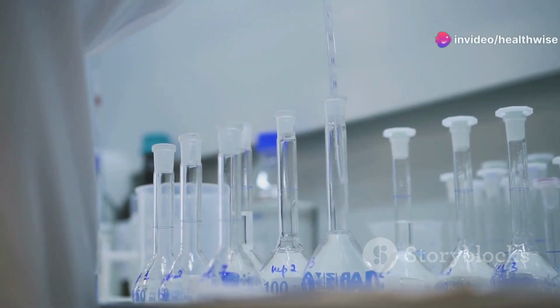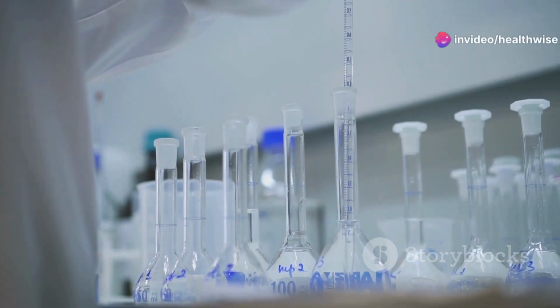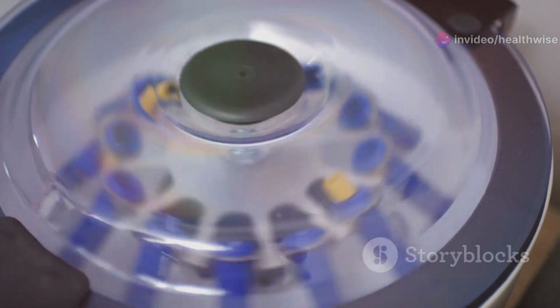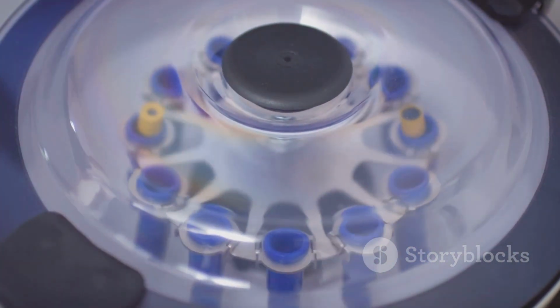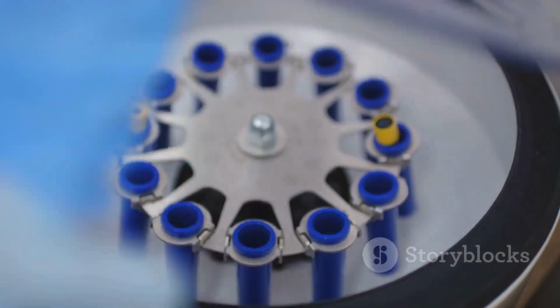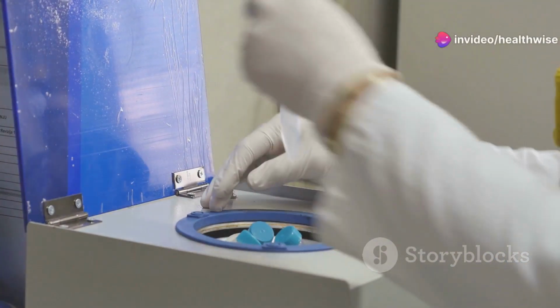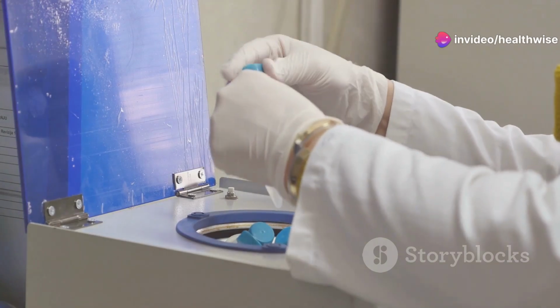3. Centrifuge at 1,500 revolutions per minute for 1 minute. 4. Decant the supernatant and resuspend the deposit in another 15 milliliters of saline. Repeat until you get a clean sediment. 5. Mix this sediment with 10 milliliters of 10% formalin and let it stand for 5 minutes.